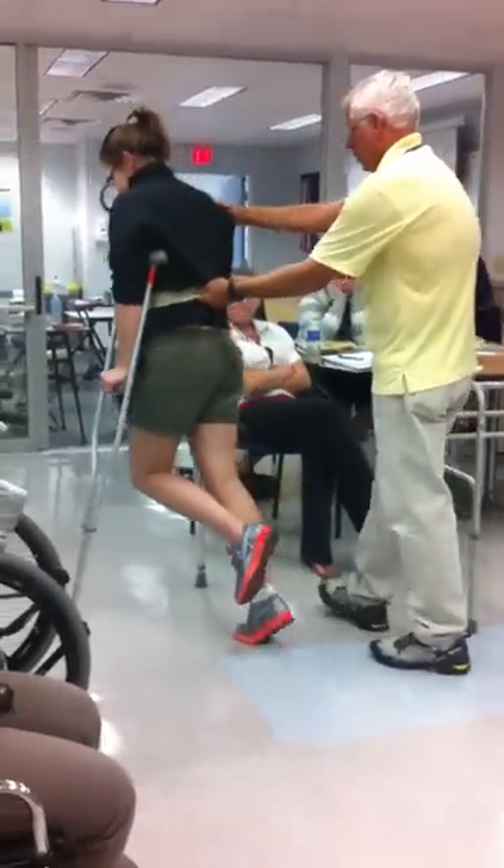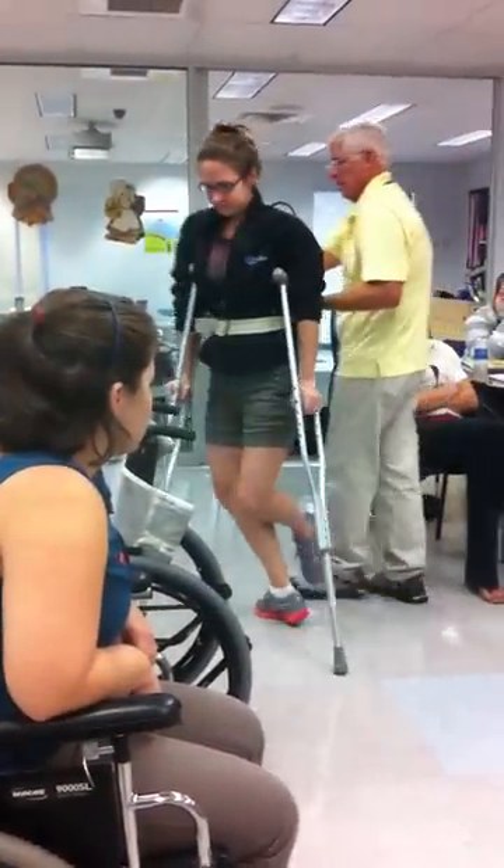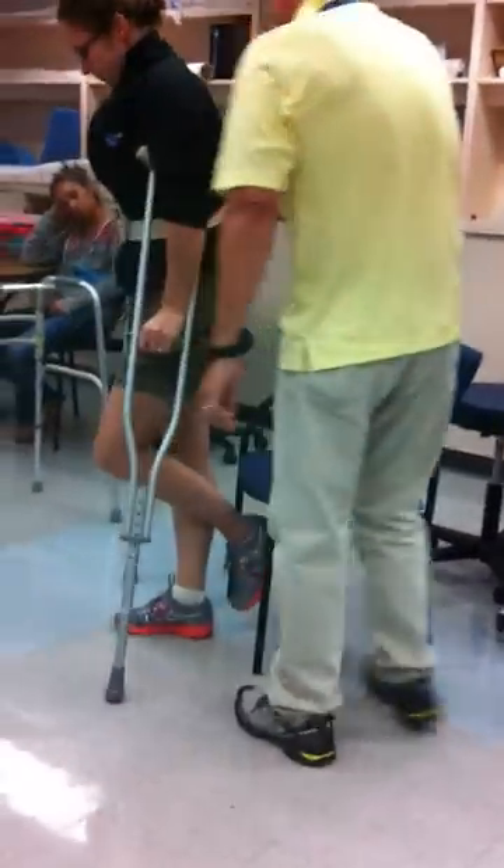Okay. Nicely done. Go ahead and circle. And take it back. So I think circle. Go past it.